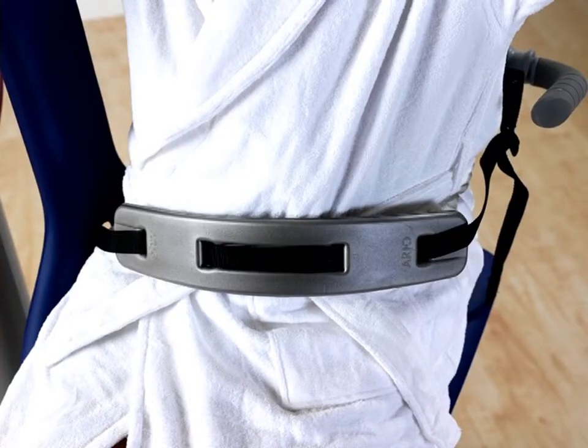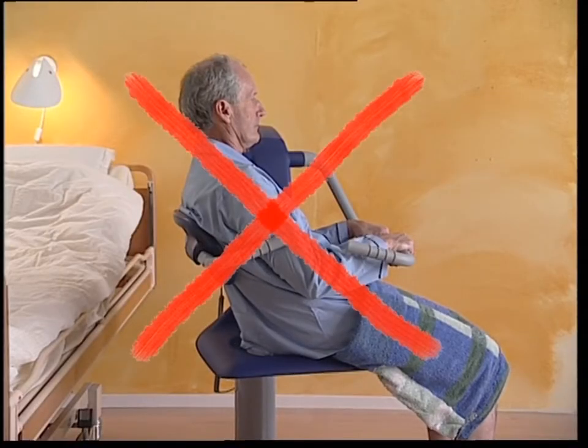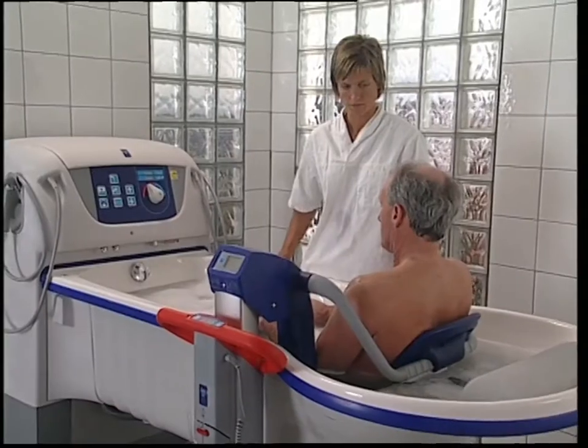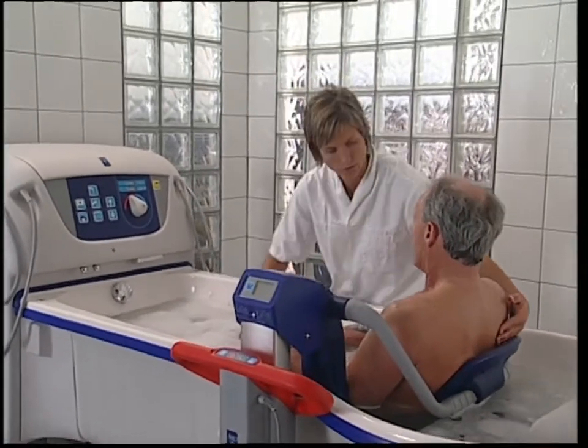The safety belt must be used at all times to make sure the resident remains in an upright position in the middle of the seat. Before lifting the Alente out of the water after a bath, reposition the resident if necessary to ensure that he or she is sitting upright in the centre of the chair.